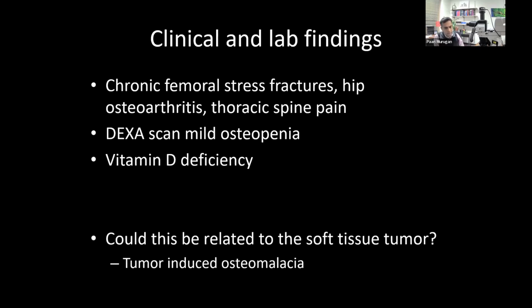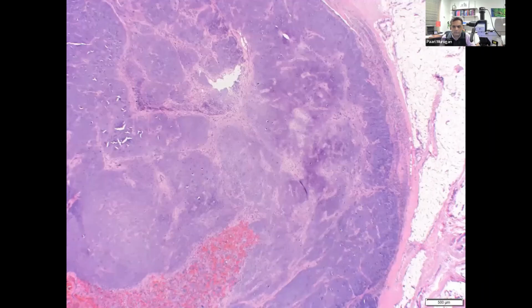So could this be some sort of tumor-induced osteomalacia? With this differential diagnosis in mind, we did offer a diagnosis, and then the tumor was resected. Before we go to the diagnosis, let's look at the resected specimen.